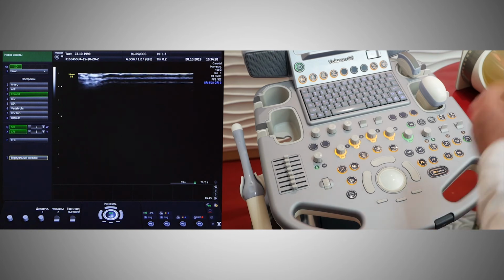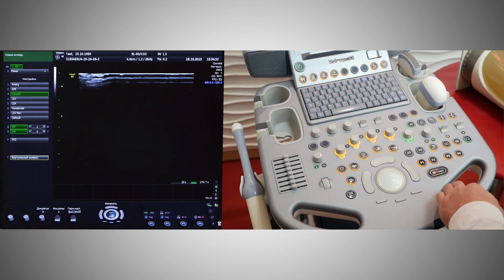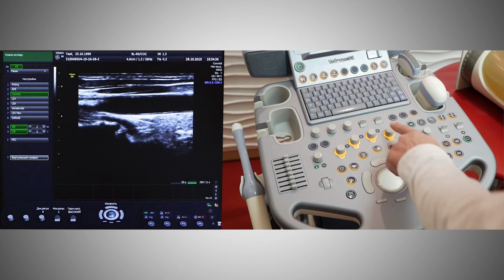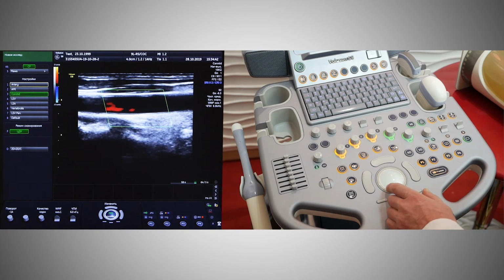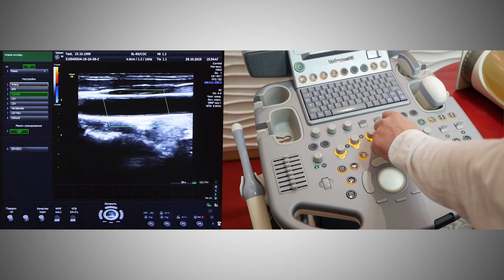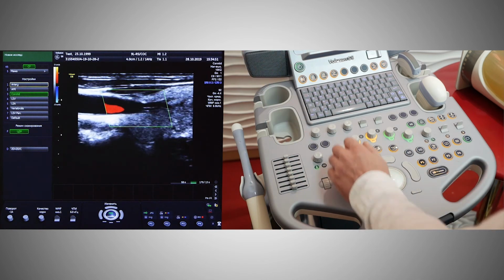2D button, 2D mode. Exits all previously enabled modes and switches to a simple scan. That's a color Doppler. Invert button. Color Doppler enhancement. Again, the scale.